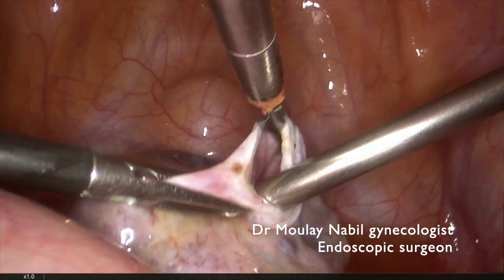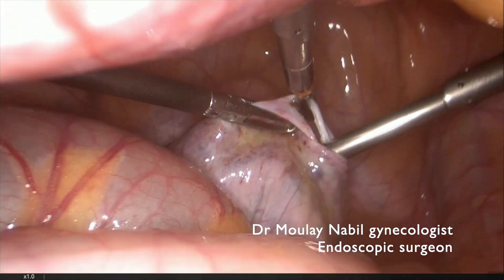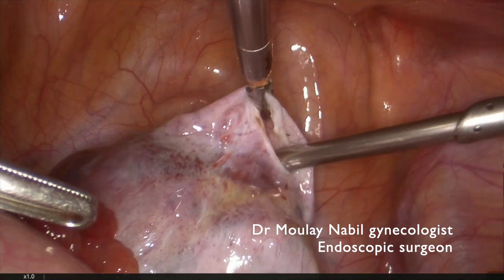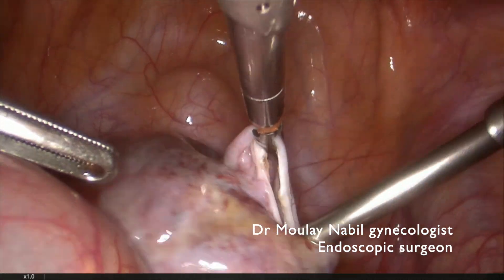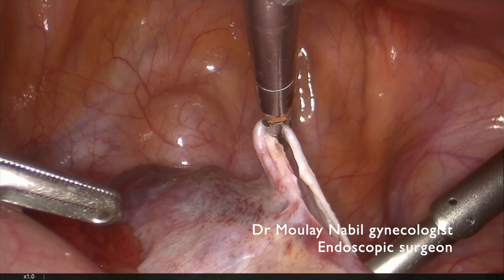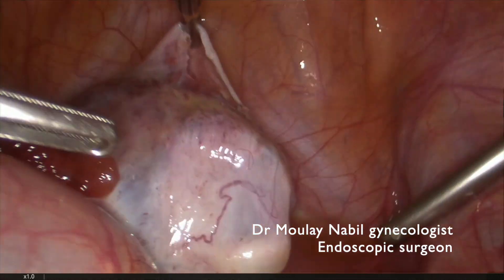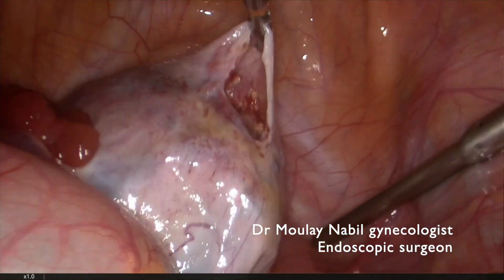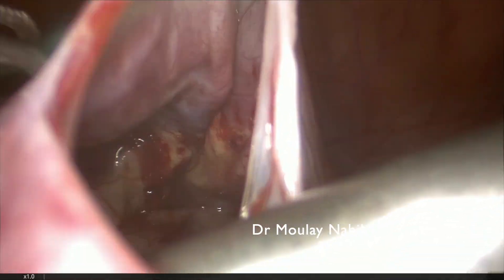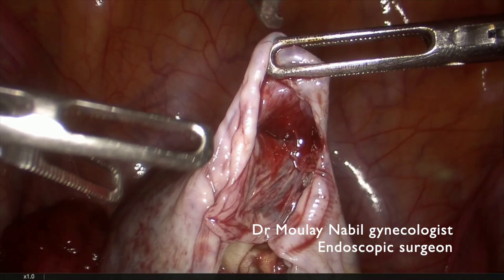The second step of the procedure is to perform a classical cystectomy for this dermoid cyst. We will begin the cystectomy after completely emptying the liquid.